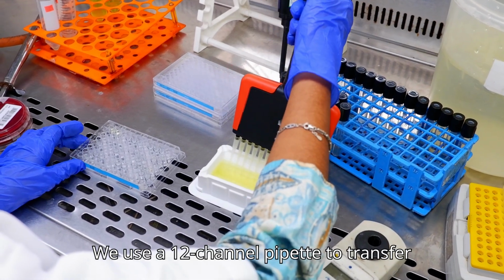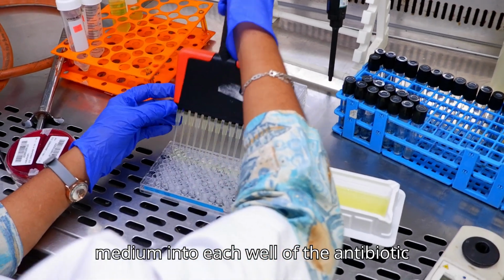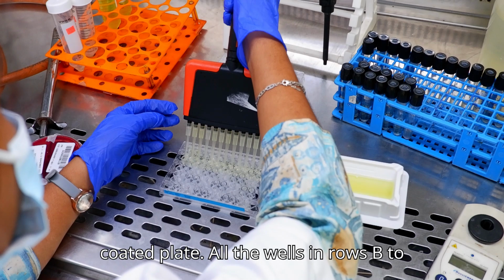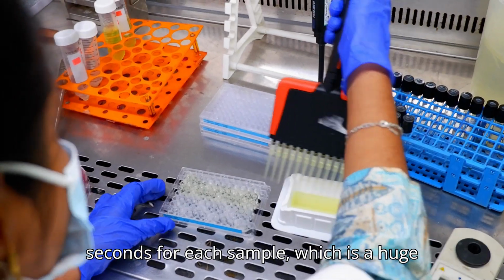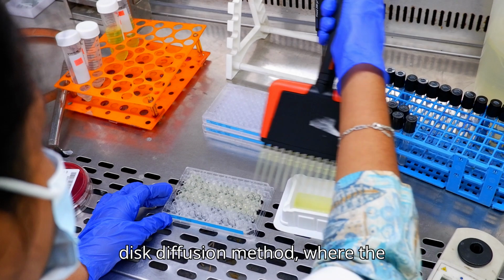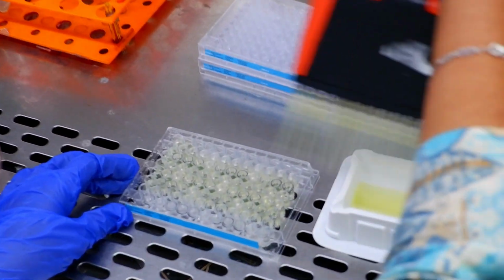We use a 12-channel pipette to transfer 200 microliters of the inoculated culture medium into each well of the antibiotic-coated plate. All the wells in rows B to H are filled with 200 microliters of the medium. This process takes only 30 seconds for each sample, which is a huge time saver compared to the traditional disc diffusion method, where the laborious culture streaking can take about 5 minutes per sample.